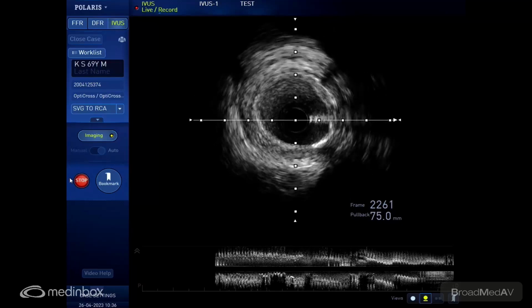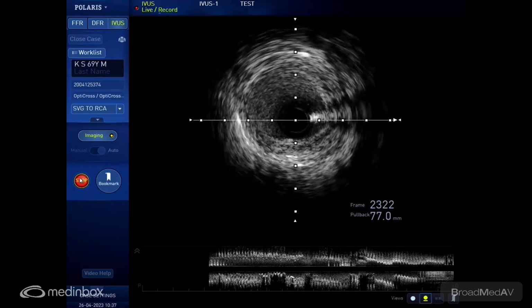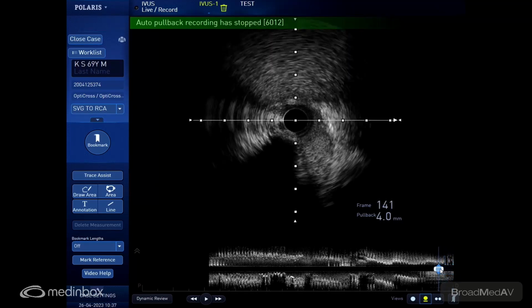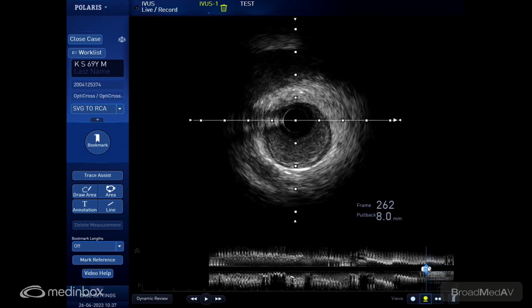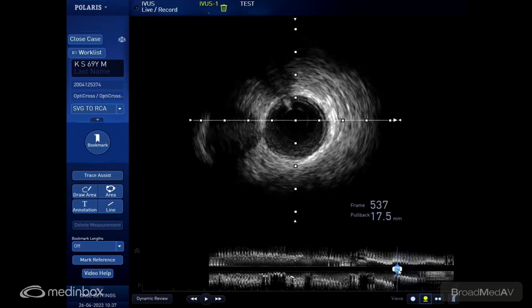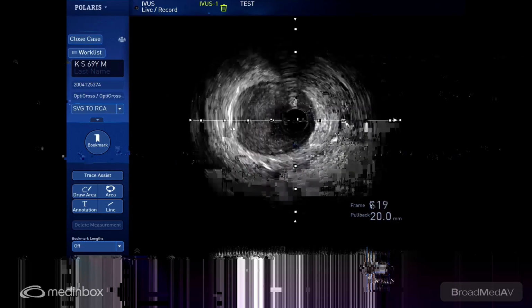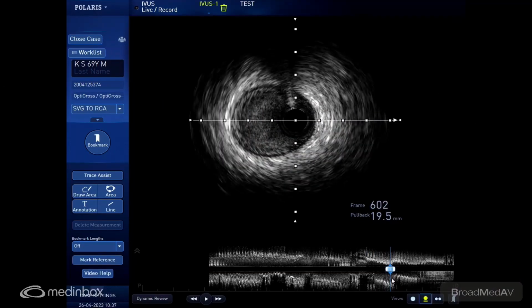So what we need to do now, Ashish, is stop over here. Yeah, we can stop here, and please tell me what the distal diameter is, what the proximal diameter of the graft is where it is normal vessel, and what size of stent we need to use.